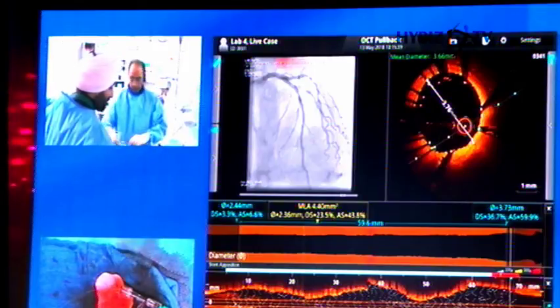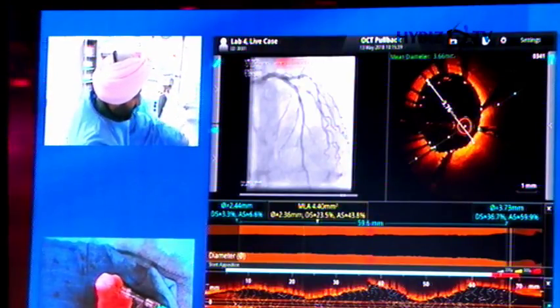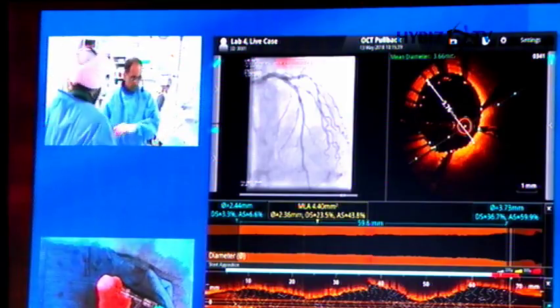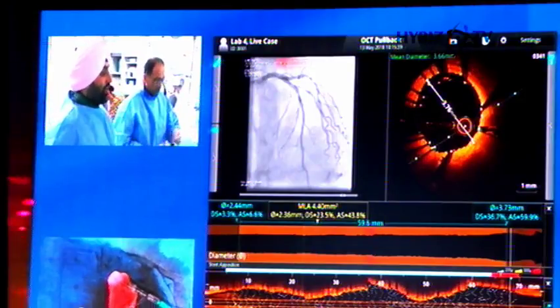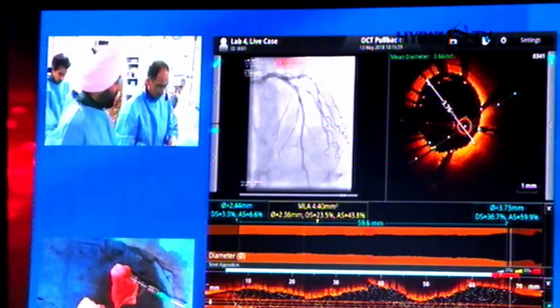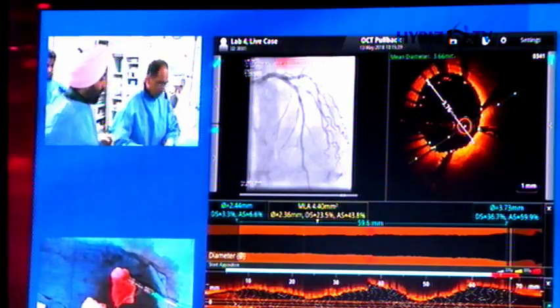I'm sure you guys are winding down, and just wanted to let you know you guys have about 5 to 7 minutes left, satellite time left. Okay, we'll just... So we're going to quickly post-dilate. Thank you for that. We're going to quickly post-dilate, do another run, and then what I want to do is just go through the stent expansion software on here and just show that we've expanded our stent appropriately.